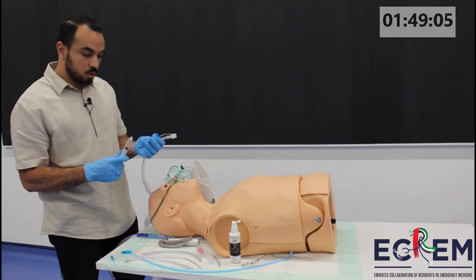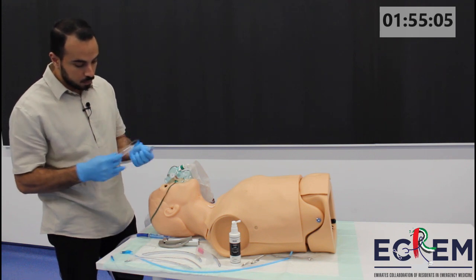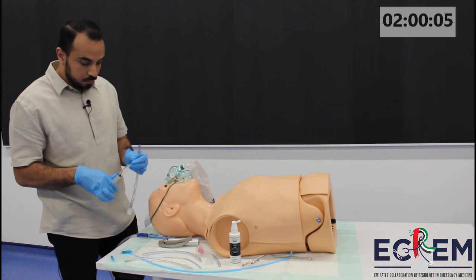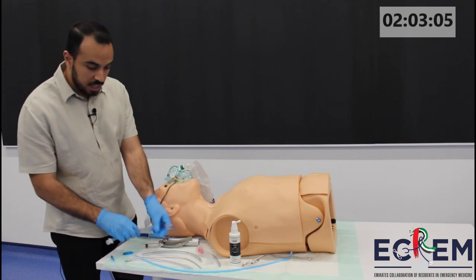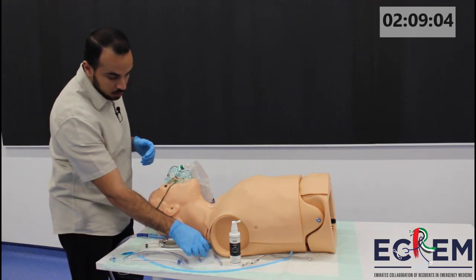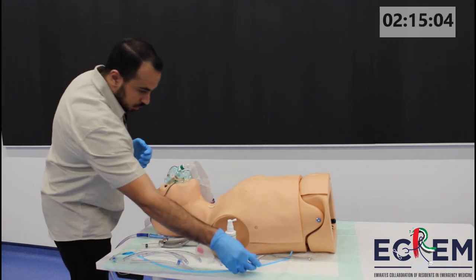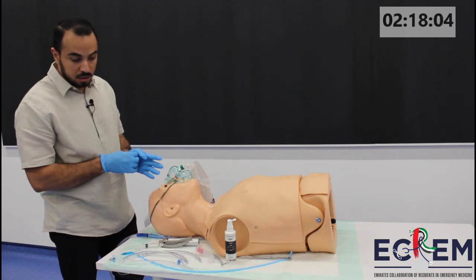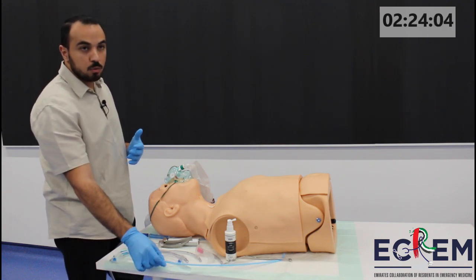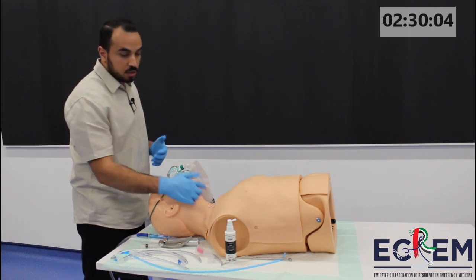We'll have a 10cc syringe to make sure that the cuff is working and there is no leak, then we'll deflate it again. I'll have my stylet that works with the ET tube I'm going to use. I'll have my gel for the tube. We'll have the Magill forceps in case there is anything in the throat that needs to be taken out. And for difficult intubation, we'll have my Bougie. I'll also make sure that there is a second kit for a surgical airway if needed.